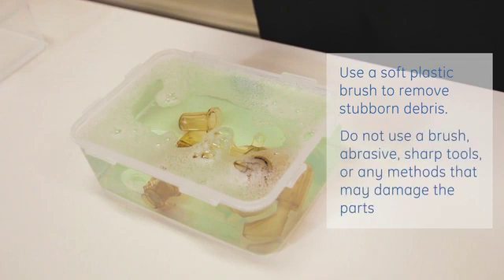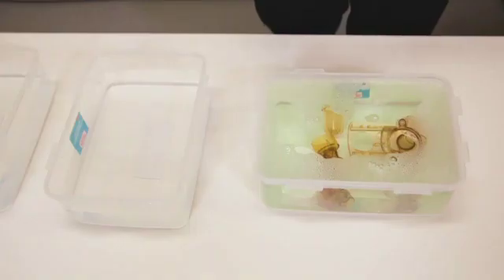Do not use a brush, abrasive sharp tools, or any methods that may damage the inside or surface of the parts.